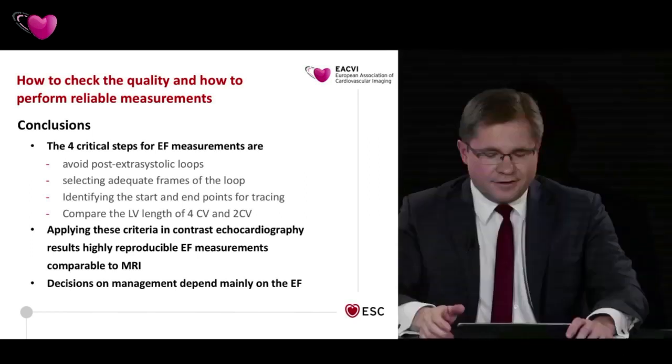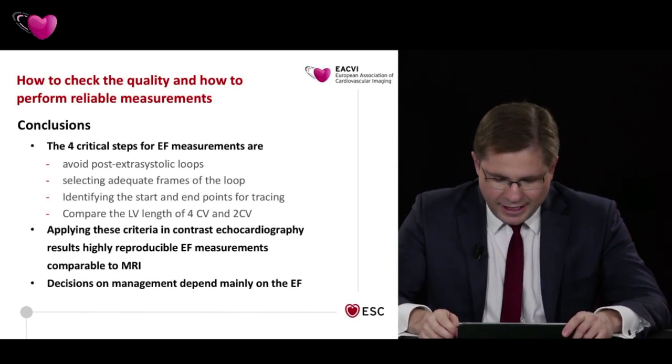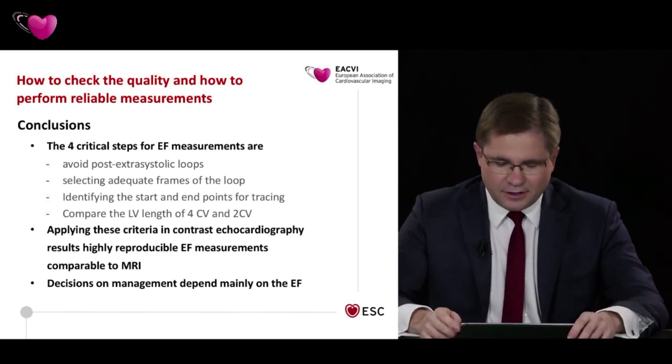Thank you for this excellent and practical presentation. I believe many of the questions that have been submitted you have answered during your presentation, but there are still a few outstanding, and I will try to group them into certain categories. There are questions pertaining to automatic delineation of the endocardium and several algorithms that are available for that. Can you comment on the usefulness of such algorithms in such patients and in contrast echocardiography?